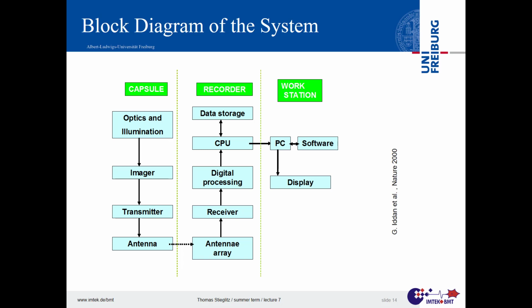That means the statement that it's watertight always comes with a time frame. And if the time frame is 48 hours, you have a larger variety of materials that you can use that let water and ions come in, but to such a small extent that the electronics is still working. If it should last for, let's say, 100 years, then the amount of materials that we could use would shrink down to probably ceramics and metals.